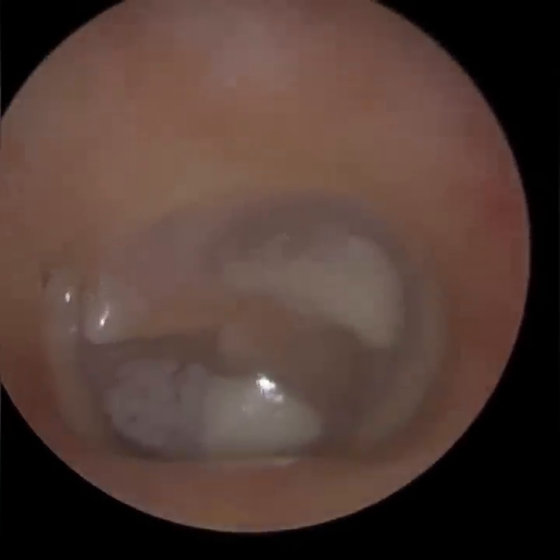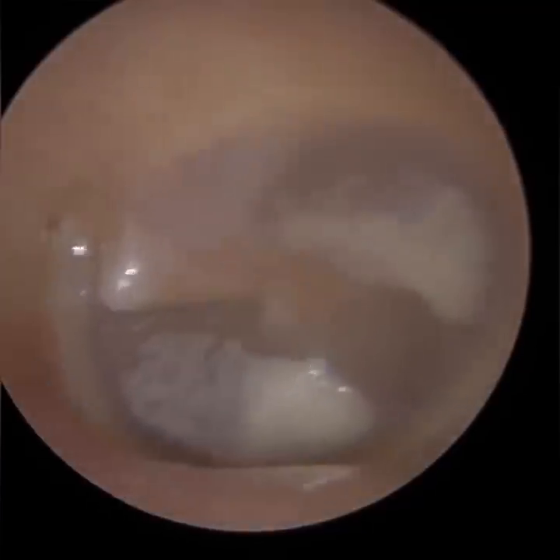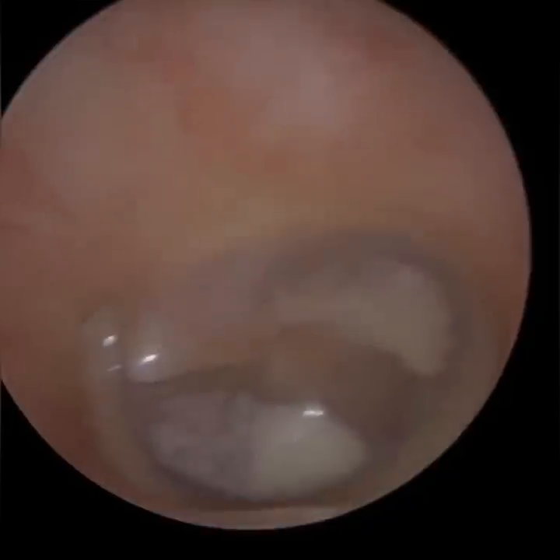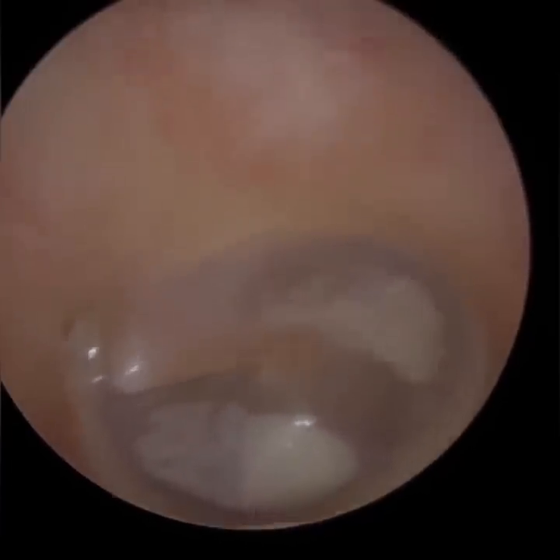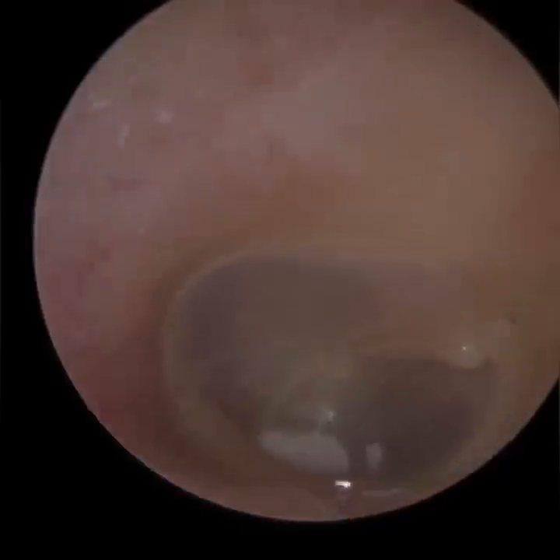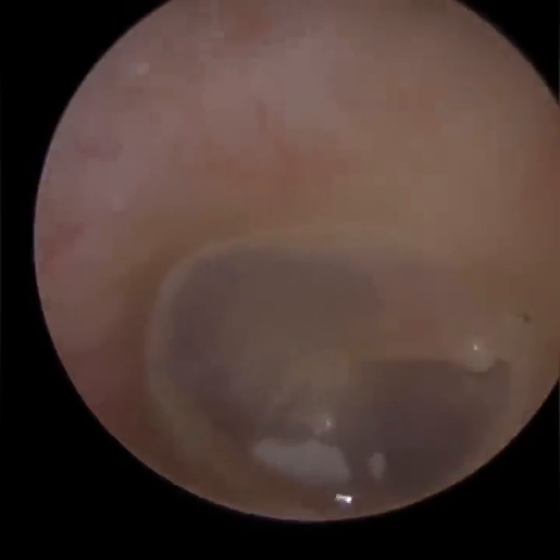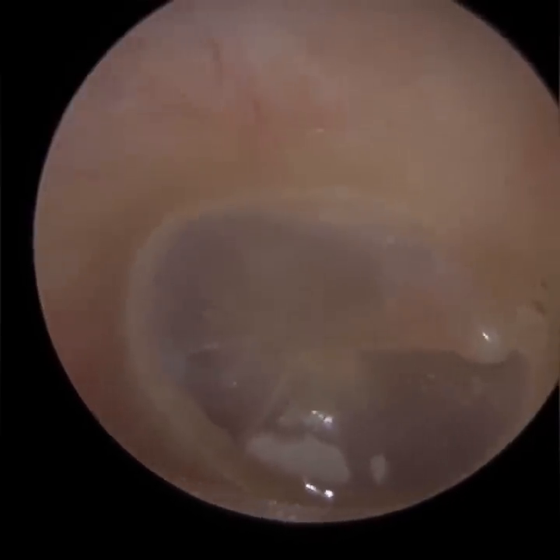But it can – for example, you can see the posterior patch is close to the hammer bone there. If the plaques impact on the bone itself, yes, possibly it can cause a hearing loss, but in the main it doesn't. It's more extensive in this patient than patient one – that was the left ear and this is the right. Here it's more in the anterior inferior quadrant – in the case of the right ear, we're talking about the southeast region. There are two little patches there.